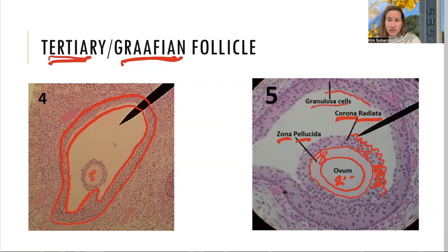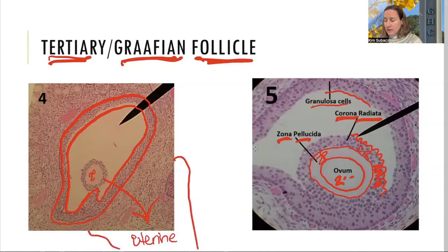When we are on day 14 of the ovarian cycle, this follicle is going to rupture and burst. So this follicle will burst on ovulation, day 14, and that egg right here is going to come out, and eventually it will pop out and it will go into the uterine tube, fallopian tube. It has like 3 or 4 different names out there, but it'll be caught. We're gonna have little fimbriae that attach on, and they are going to catch it like a little catcher's mitt, catch the egg, and it will go through the fallopian tube on ovulation. So this is very much well developed.